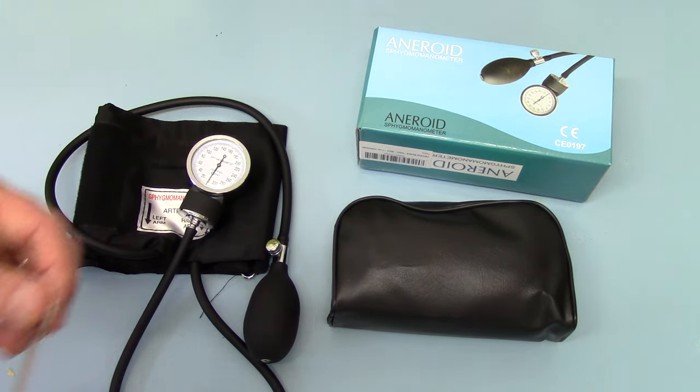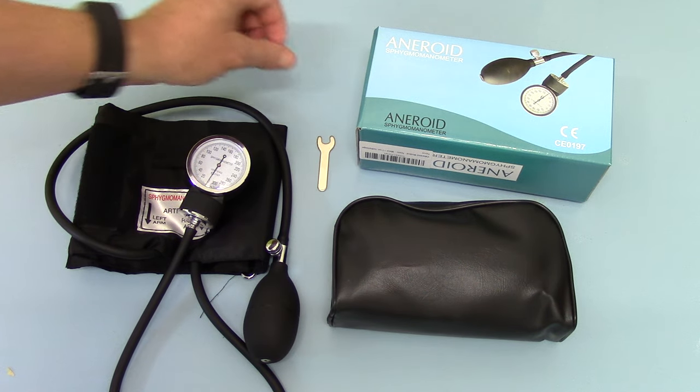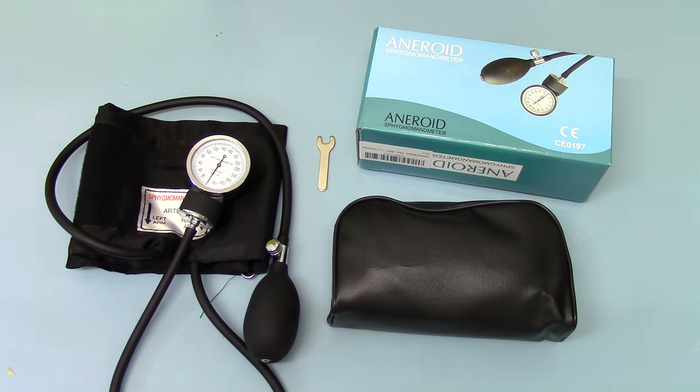It's very easy to do. Keep that tool somewhere safe because over time, if the unit is dropped, it can again lose its settings. So you just want to bring it back to zero — that is simply setting it on zero at zero pressure.